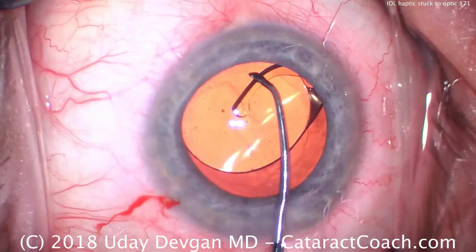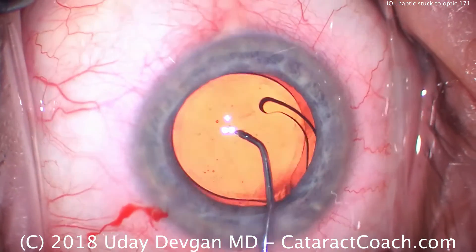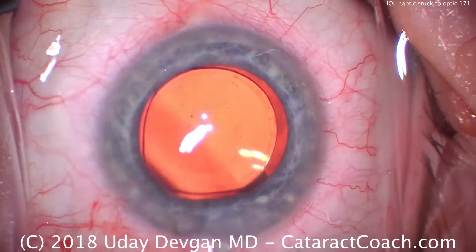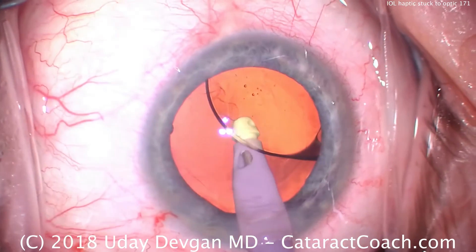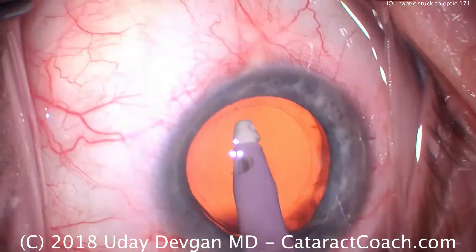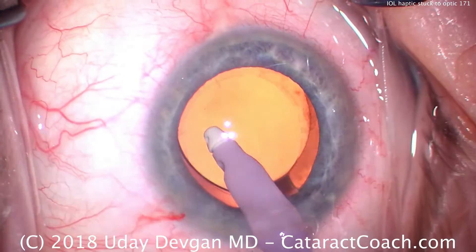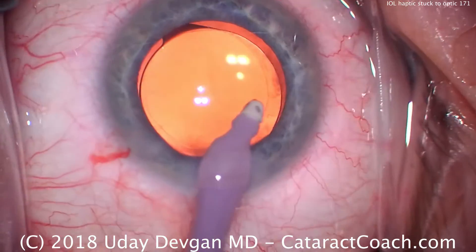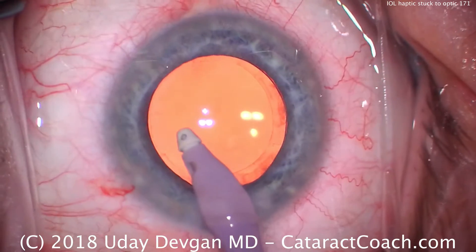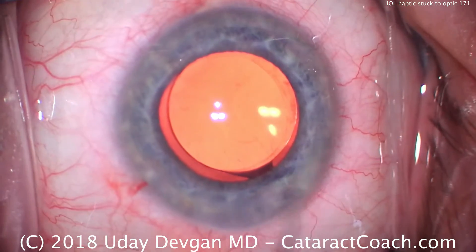What are our options now? Some people use forceps and squeeze the haptic. In this case, I tend to just push a little bit more, and eventually it breaks that grip and releases. The error here was we didn't put enough viscoelastic into the injector, and that's because we ran out. Being a large, highly myopic eye with a large anterior chamber volume, we ran low on the dispersive, and my technician didn't want to use any of the cohesive injector. So in retrospect, I would have used any viscoelastic available — dispersive or cohesive — just to have something in the injector. Without the viscoelastic, or at least some saline covering the lens, the lens tends to be slightly tacky and the haptics tend to stick to the optic. We want to avoid that, obviously.